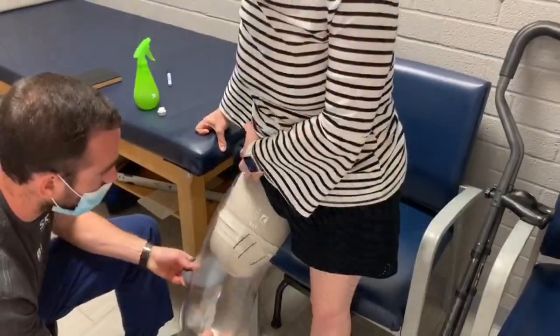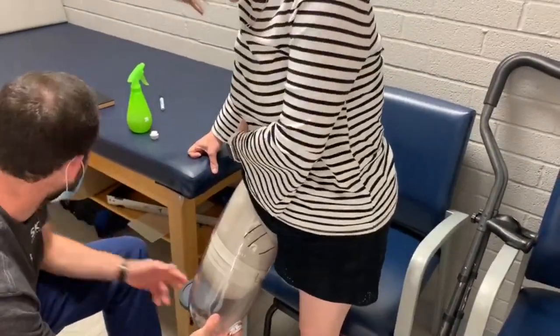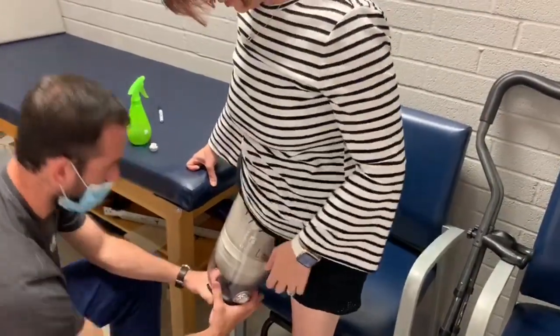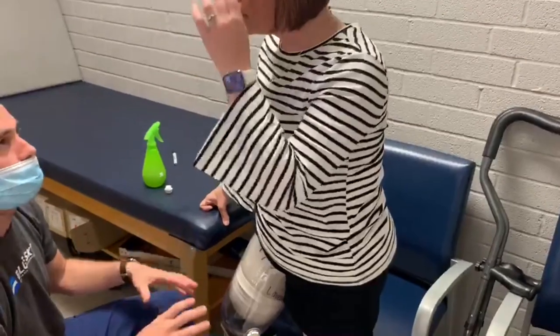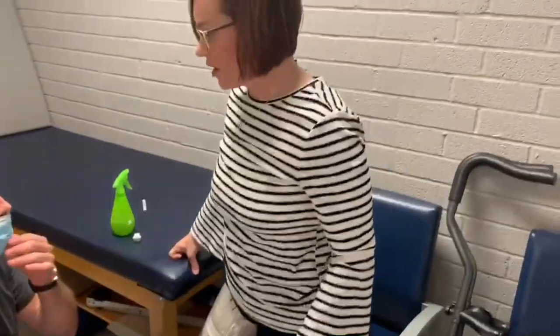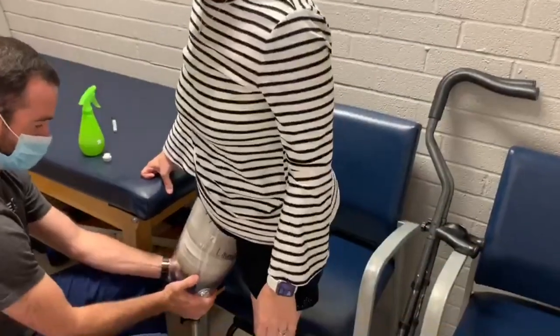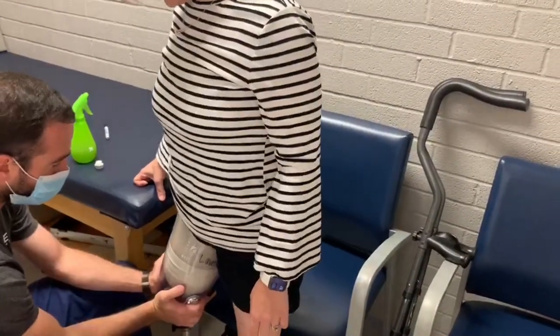So you're probably still good. What you're about to feel isn't how it's going to feel three weeks from now. So don't get hung up on what it's feeling just yet. Just slowly put a little pressure into it.